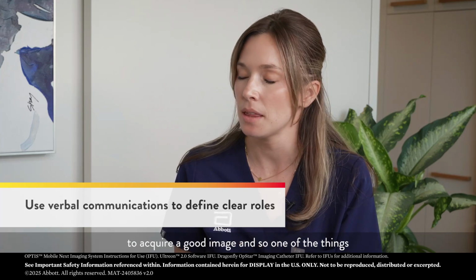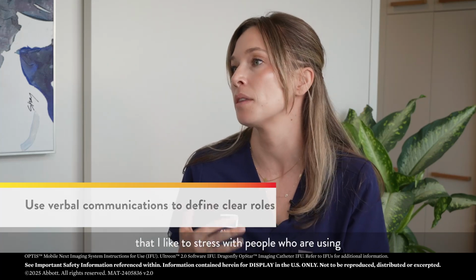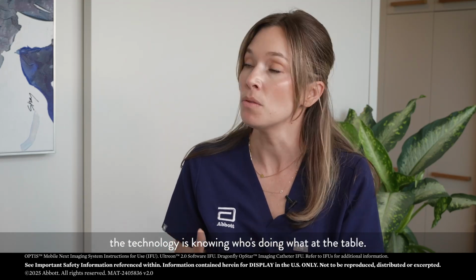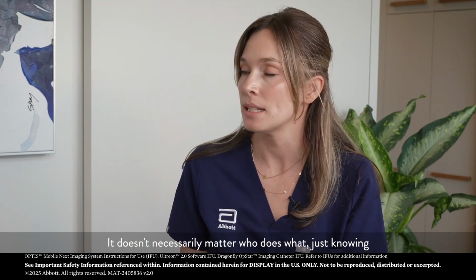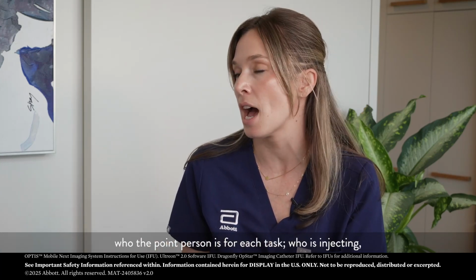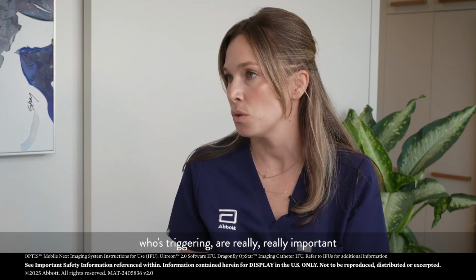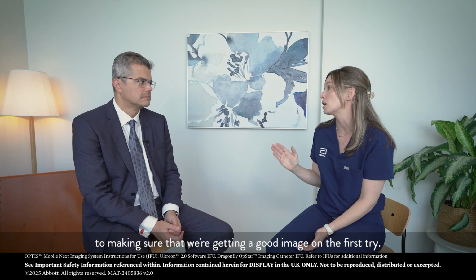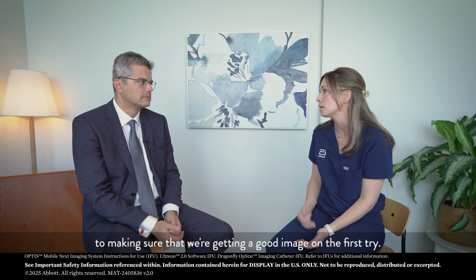One of the things I like to stress with people using the technology is knowing who's doing what at the table. It doesn't necessarily matter who does what, just knowing who the point person is for each task, who is injecting, who's triggering, is really important to making sure that we're getting a good image on the first try.